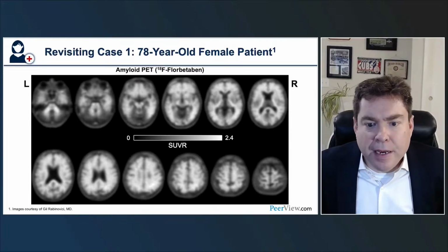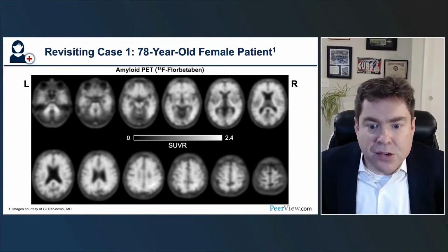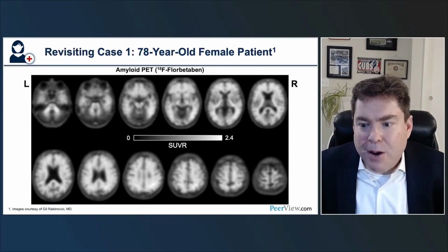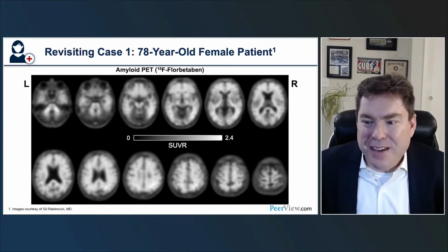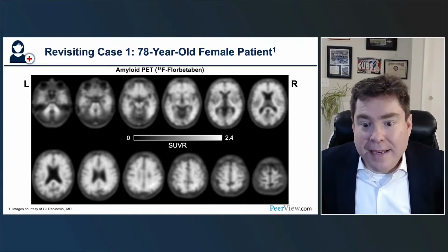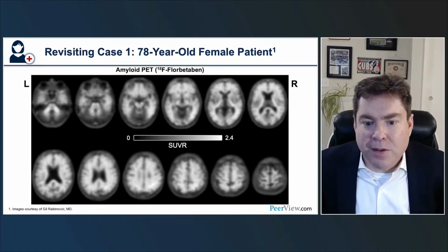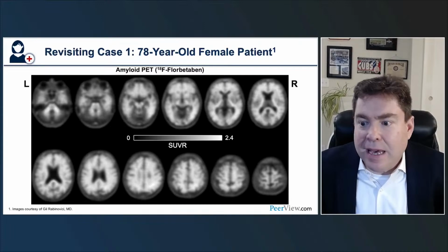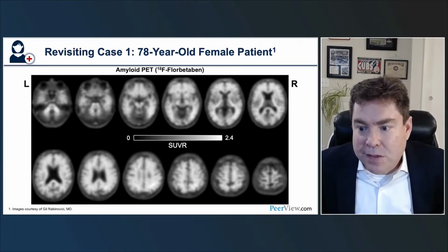So, with the new criteria, the amyloid PET in and of itself would be sufficient for diagnosing Alzheimer's disease. I would have high suspicion that Alzheimer's is contributing to the patient's impairment because it was memory and the family history was strong. But you're right. I think the positive predictive value in terms of thinking about whether the amyloid is related to impairment is less clear with amyloid PET alone in older individuals. In your younger patient, it may be more illuminating because the likelihood of being amyloid positive at age 63, if you don't have symptomatic Alzheimer's, is pretty low.